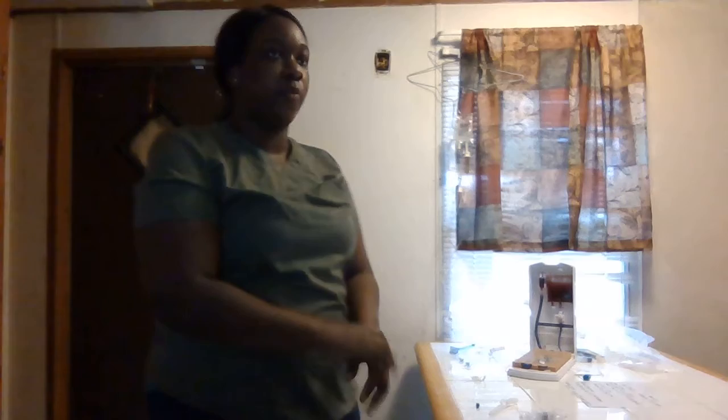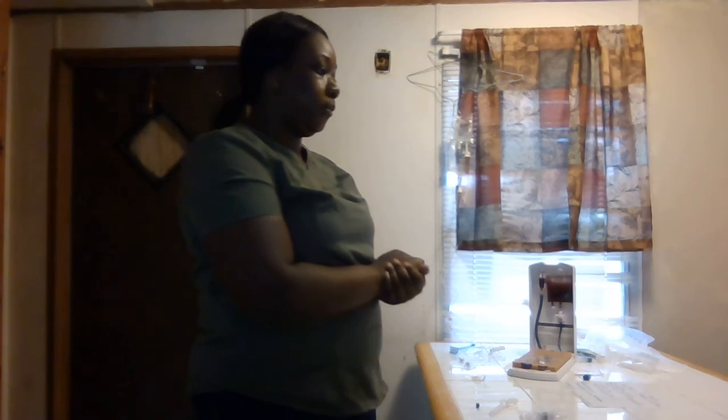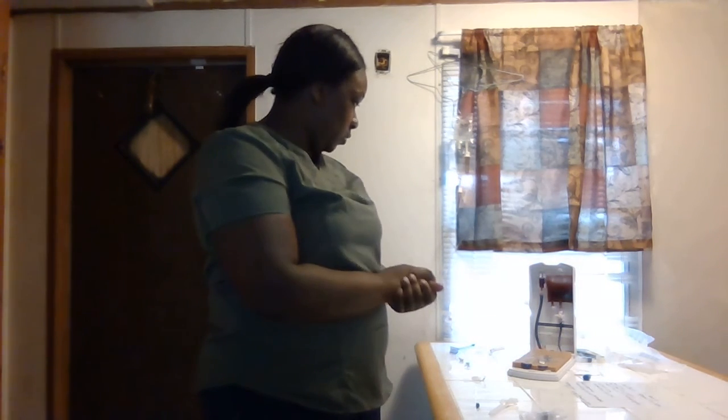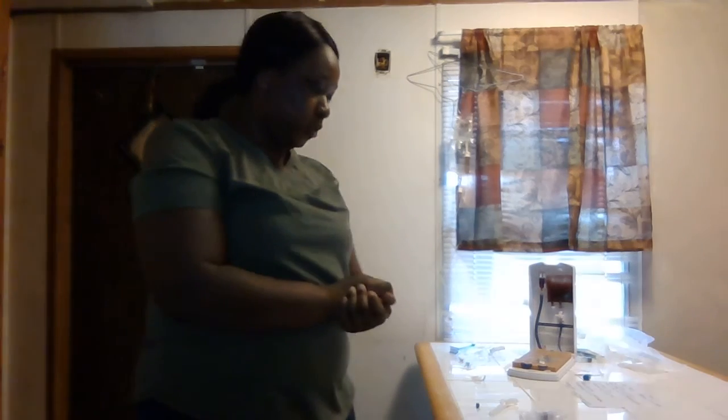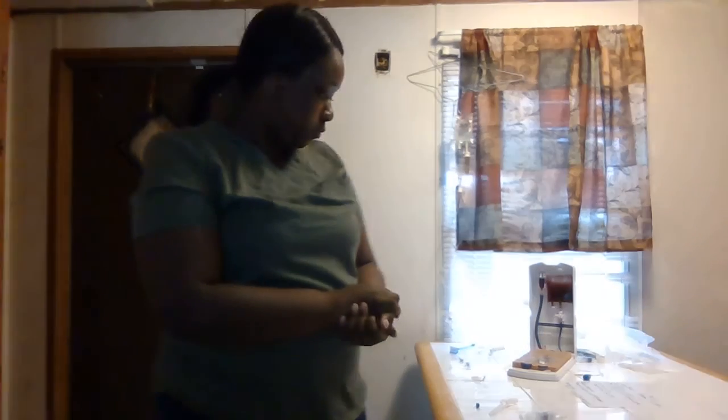We're going to flush again, as always before and after, with the normal saline. Always prime them, make sure you don't have any air in them. Once we flush it, we're good to go, and we always monitor our patient for any adverse reactions to the medication. And being that this is a medicine, I will go ahead and record it, document it on my MAR.